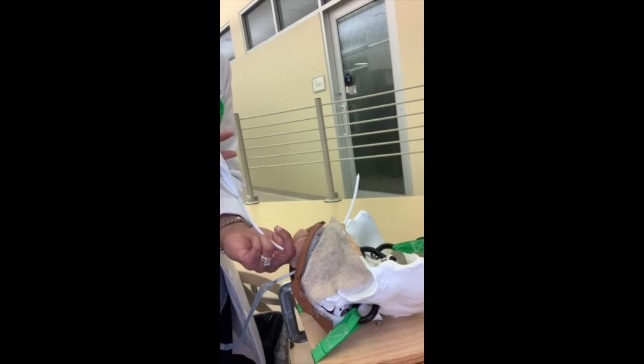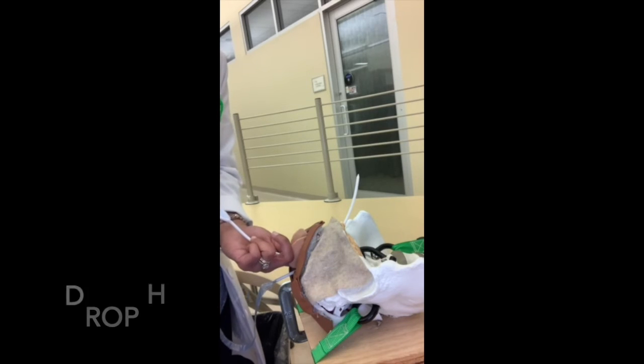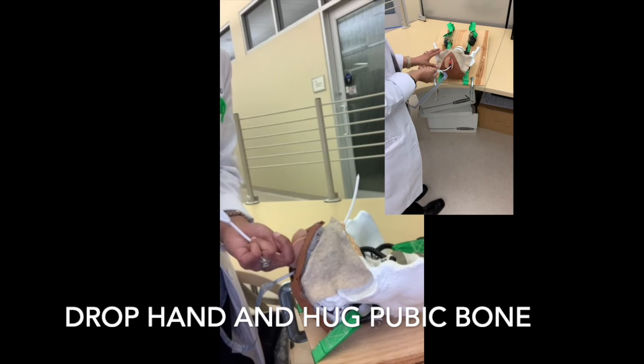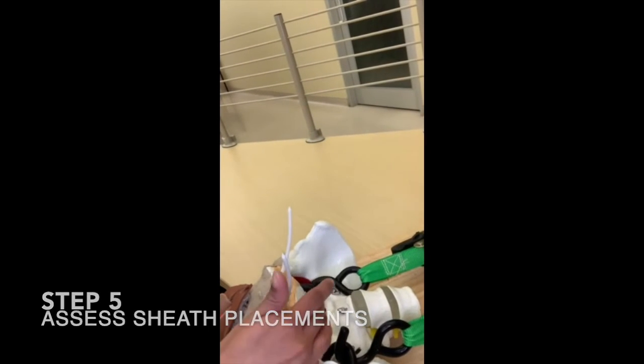As soon as the tip passes the inferior pubic rami and it's going through the urogenital diaphragm, immediately you drop your hand. Very important to make sure that the trocar is behind the bone before you drop your hand. Otherwise, you're going to place it in the labia. And it's coming out, hugging the bone. And this is exactly where you want it to be, around 1 to 2 centimeters off the midline, completely hugging the bone, away from the bladder, away from the urethra, which is in the middle.